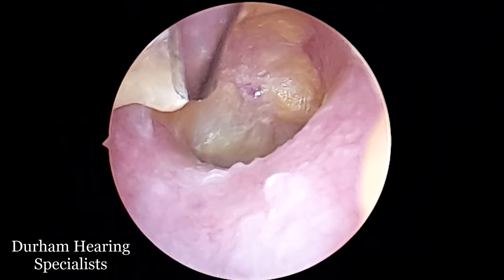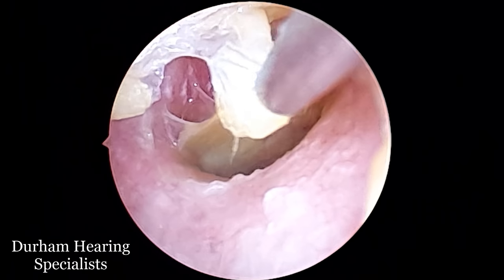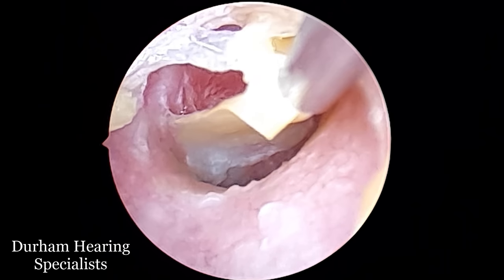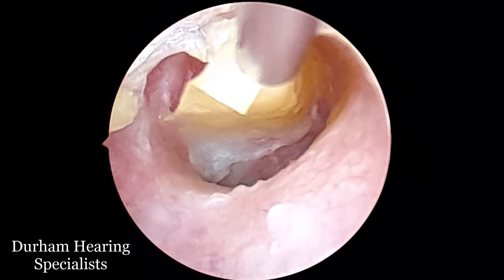And then you'll see it all come off basically in one piece — it's almost sliding off really, not really peeling it. So the sodium bicarb had done its job quite clearly.